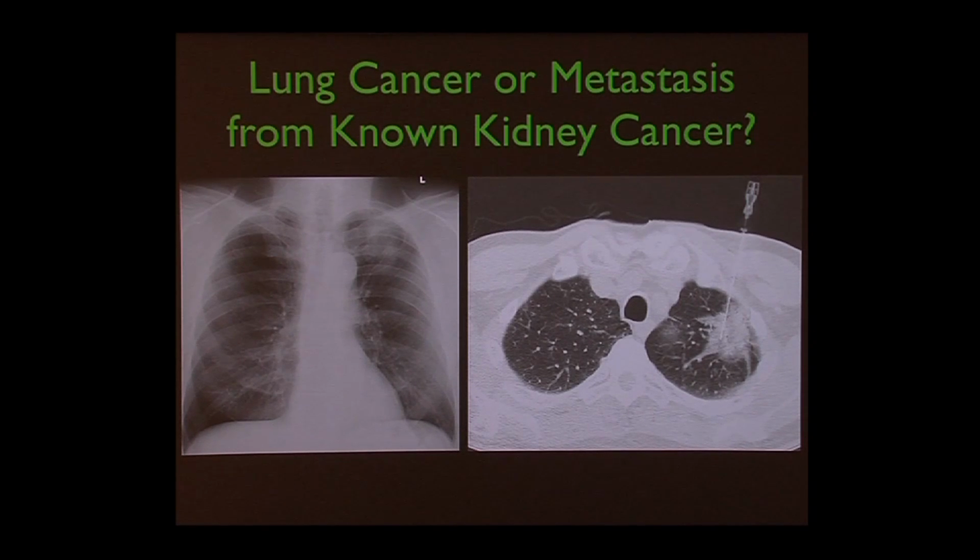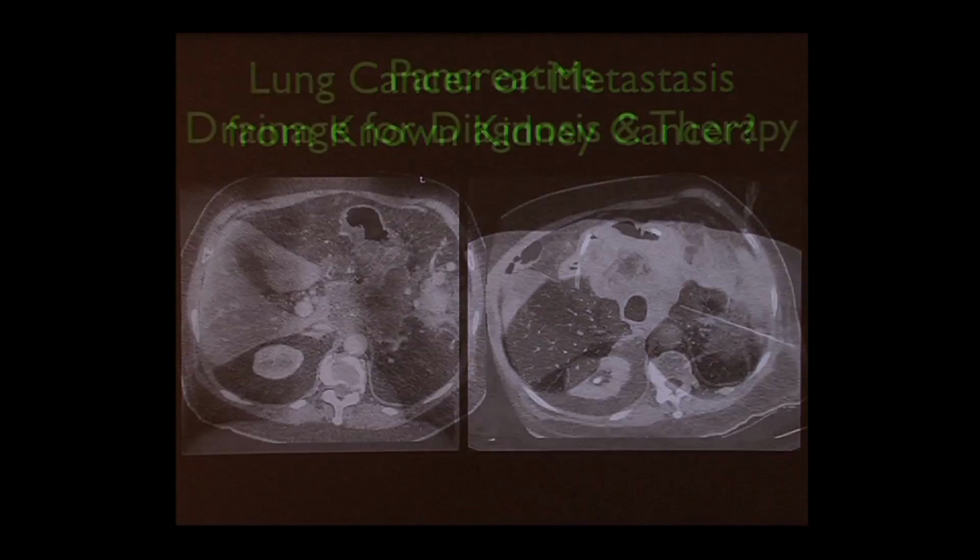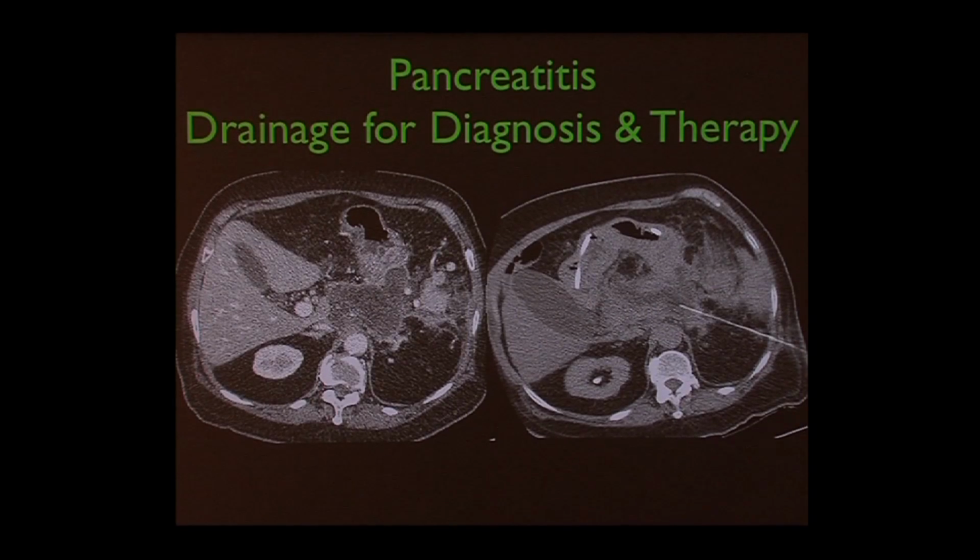So the pathologist says, I don't see any tumor, but I'm not sure you actually got it. Well, we can see that the needle's in the tumor. So it has those kinds of useful aspects.